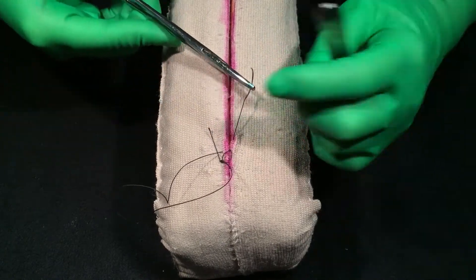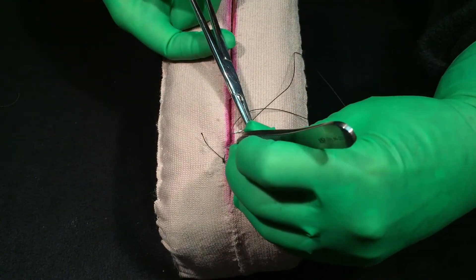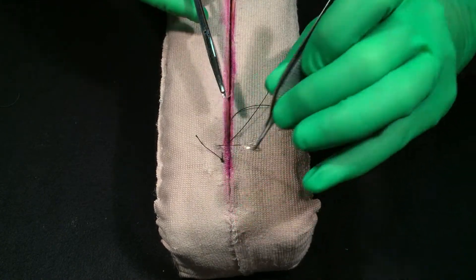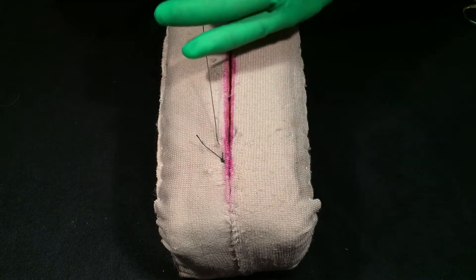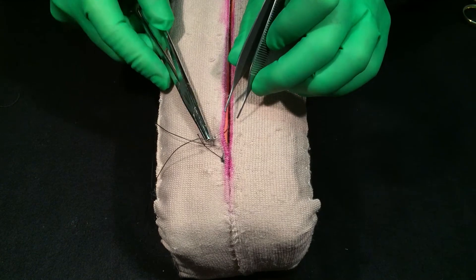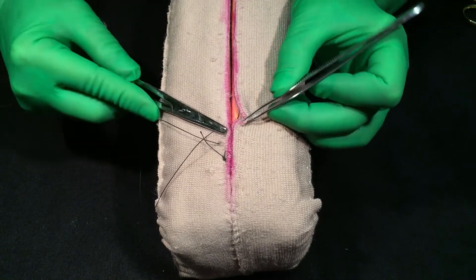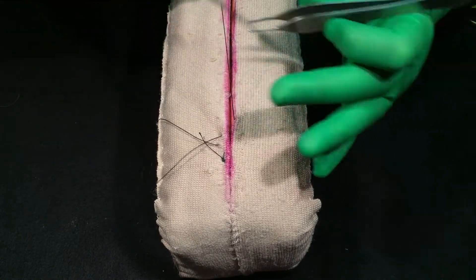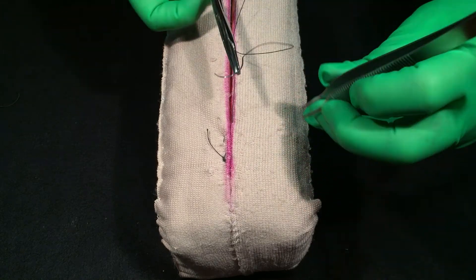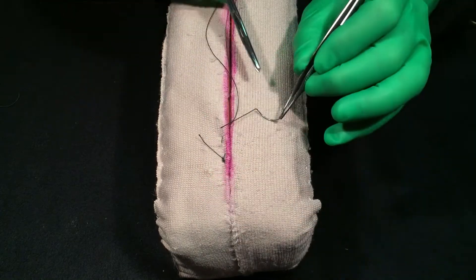Back to the nipple side — a horizontal mattress. The quicker way, once you get depth and depending on where you are, you can go through one side and then grab the nipple side and the skin side and go ahead and do that. That does save a step, but I won't suggest that when you're first doing it, because you want to make sure it sits okay. This is for after you're pretty comfortable with what you're doing.